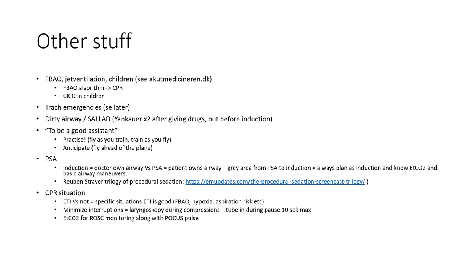And therefore, you can instruct the anesthesiologist to look during CPR and then use the 5, maximally 10 seconds when there's a break, a pulse or a rhythm check, to put the tube in. Okay. And then, once the tube is in, you can do continuous ventilation.